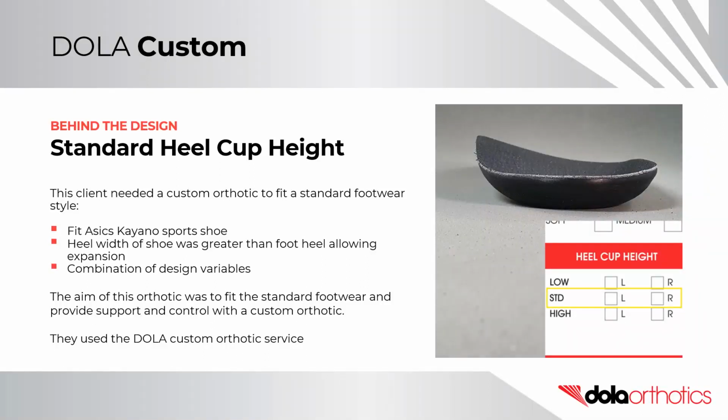Behind the design, standard heel cup height. This client needed a custom orthotic to fit a standard footwear style. It is designed to fit the Asics Kayano sports shoe. The heel width of the shoe was greater than the foot, allowing heel expansion.